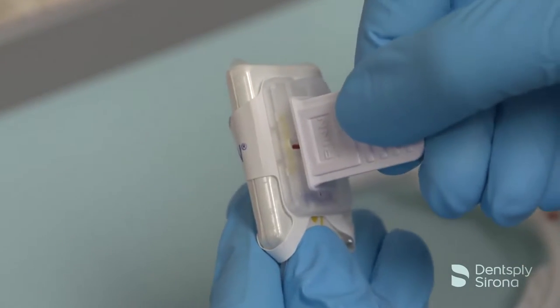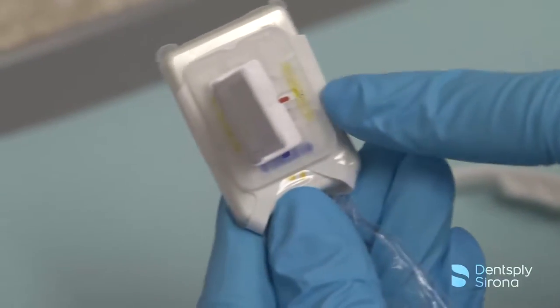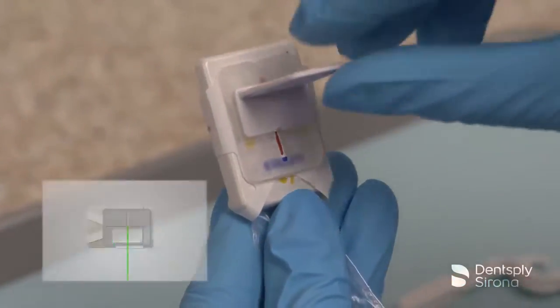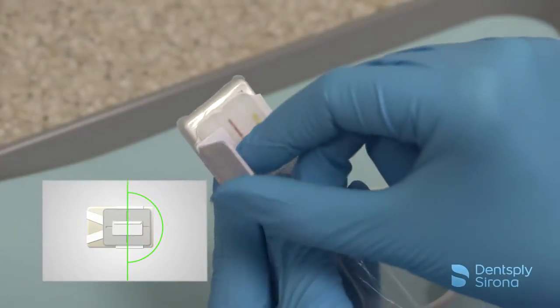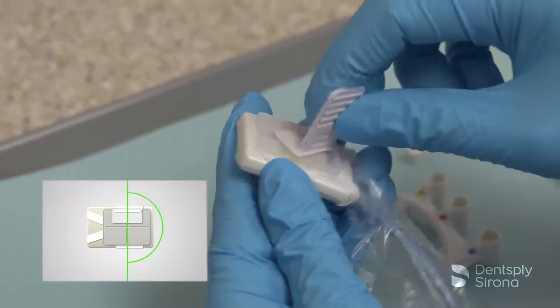The bite piece can rotate anywhere on the base. Before moving the bite piece to the next position, it is easiest to fully rotate it 180 degrees. Always go back to the center or neutral position before moving to the next area.